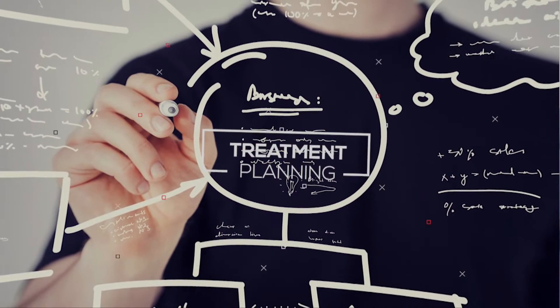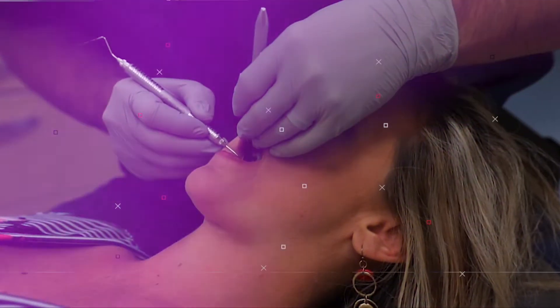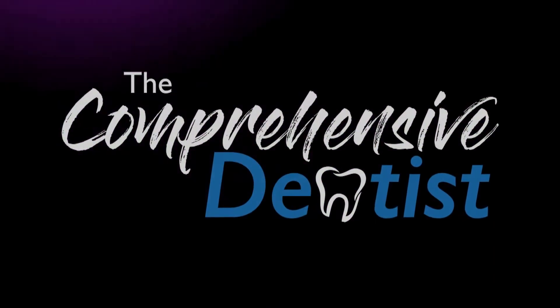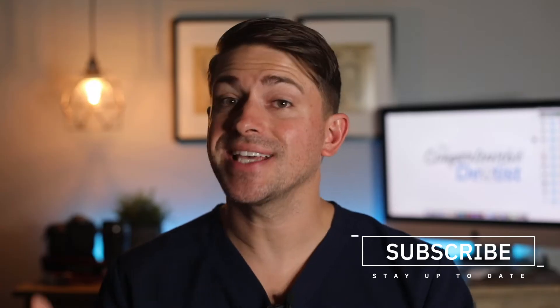The last time we went over how to shoot extraoral dental photos. In this video we are going to go over how to shoot intraoral images. Hello and welcome to another video from the Comprehensive Dentist. My name is Dr. B and in this video we are going to continue learning how to take dental photographs of our patients. Today we are going to learn how to shoot intraoral images using retractors and mirrors.